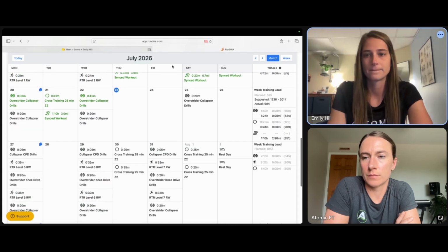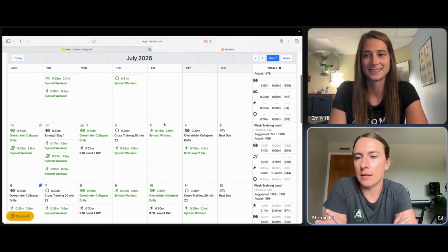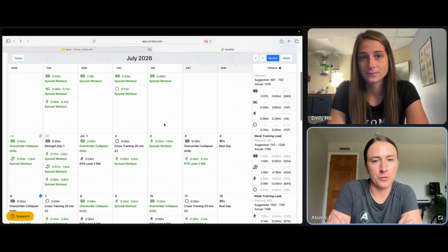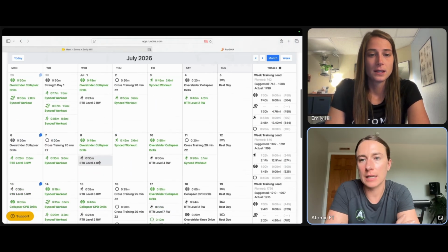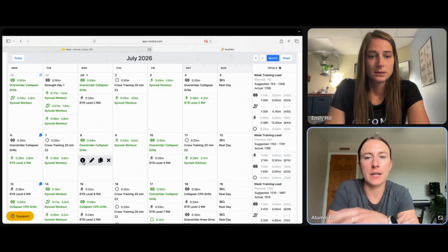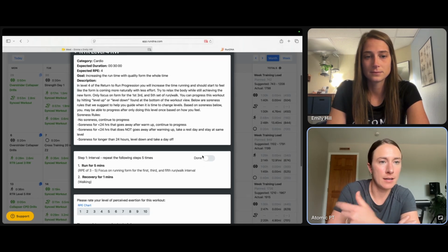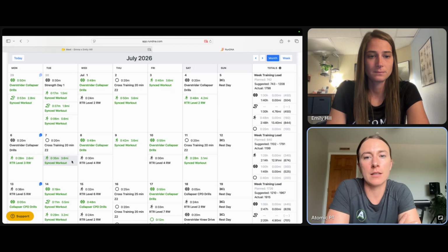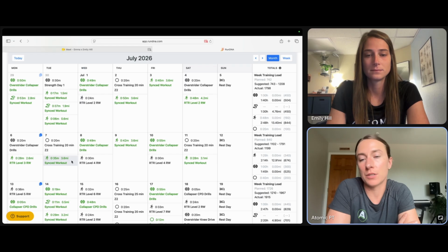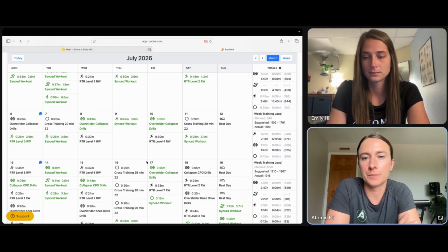Okay. And then it looks like also on the calendar, there's a potential for a return to run program, if I'm taking time off of my running. Yeah, I see on there there's various days, and it also attaches to a Garmin. So I can wake up in the morning and already see my preset return to run on my watch, which is really cool because it's been nice to be able to use that as I go.